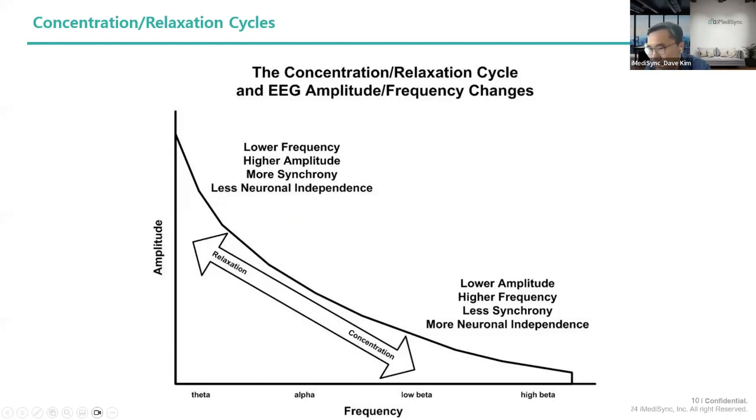This is the frequency. If the frequency increases, the amplitude usually drops like this, because low frequency usually means high amplitude, and high frequency usually means low amplitude.